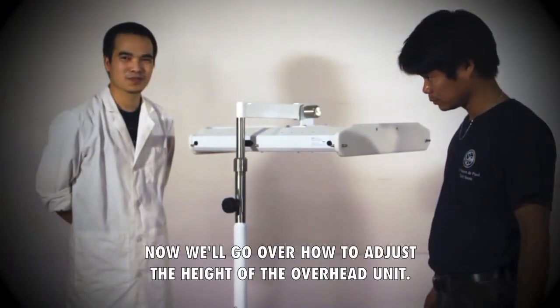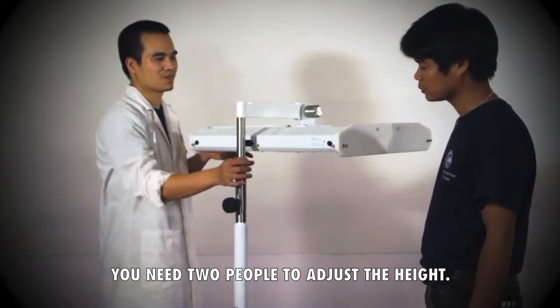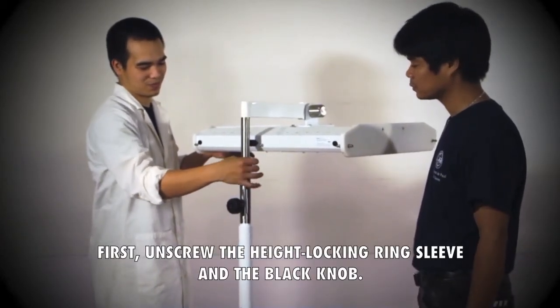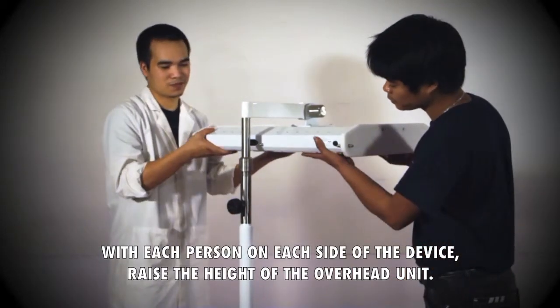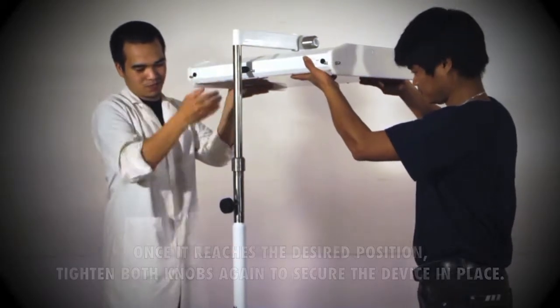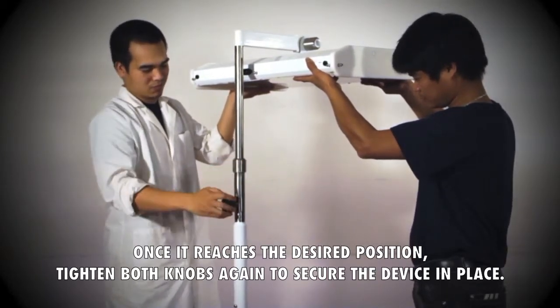Now we'll go over how to adjust the height of the overhead unit. You need two people to adjust the height. First, unscrew the height locking ring sleeve and the black knob. With each person on each side of the device, raise the height of the overhead unit. Once it reaches the desired position, tighten both knobs again to secure the device in place.